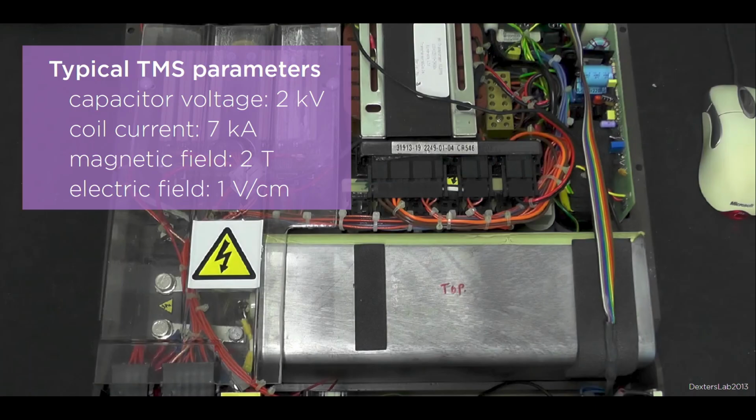When you open up a typical TMS device, you can see a number of components, including a very large capacitor, which in operation is charged up to 2 kilovolts of voltage. The delivered current to the TMS coil is upwards of 7,000 amps or 7 kiloamps, producing a magnetic field at the surface of the coil of around 2 Tesla. However, it only generates an electric field in the brain on the order of 1 volt per centimeter or 100 volts per meter, which is quite small.